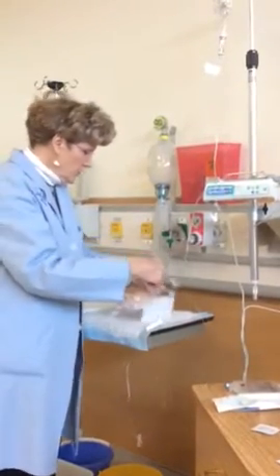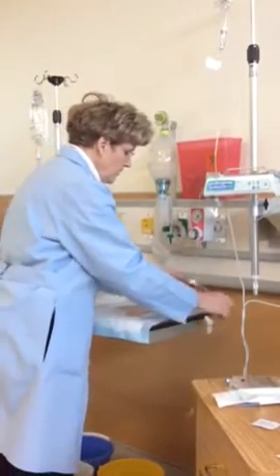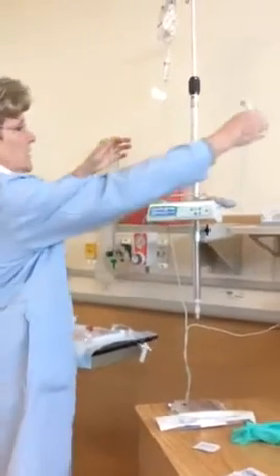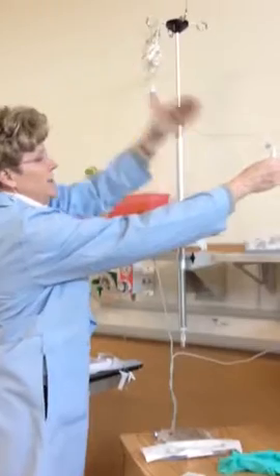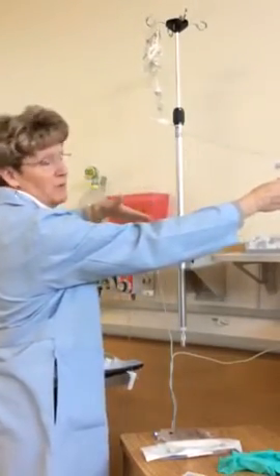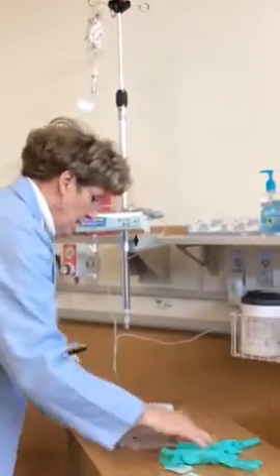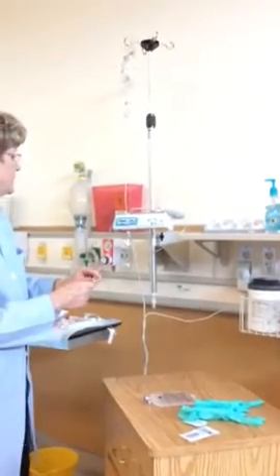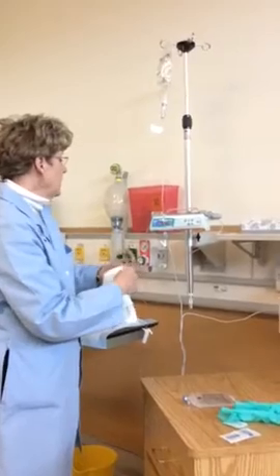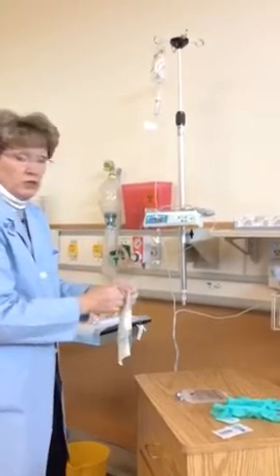The other thing that's a sure tell for you is the tubing's awfully short, and it would be a hard reach to make it down to that lower port. So always hold it up here. Here's my bag, here's my port, here's my pump. I need to be coming into the Y site above my pump. All right, so let's get started. I'm going to get my tubing ready, and I'm going to go ahead and get my pump running here because I just flushed my IV and it's happy. So our primary saline bag solution is running.